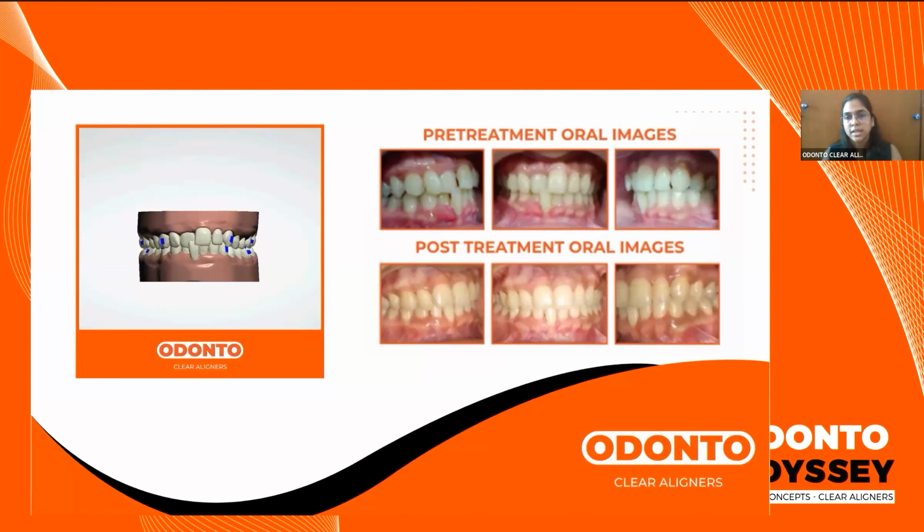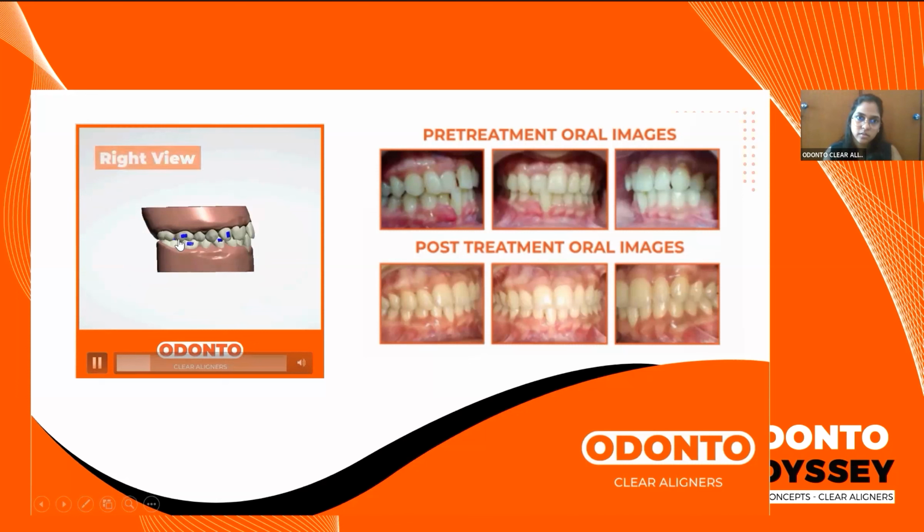In case of blocked out incisors, even if it's just a single incisor, but when the bite is overlapping, then we program something which is like a bite ramp, which helps to disocclude the teeth posteriorly so that as the teeth are crossing over, we have correction of the bite. We do not have a lot of occlusal interferences, which helps. So there will be bite ramps also, which will be programmed into your treatment plan for the correction. And this is how we can have a look. Some amount of intrusion is required. And then we have the anterior overjet, which is again well established.